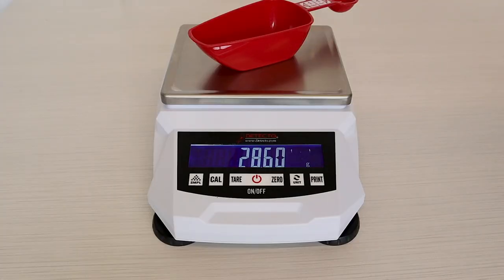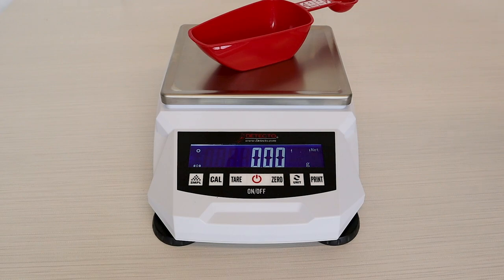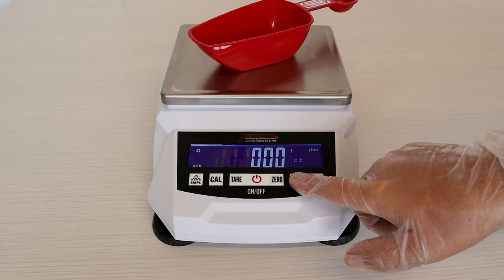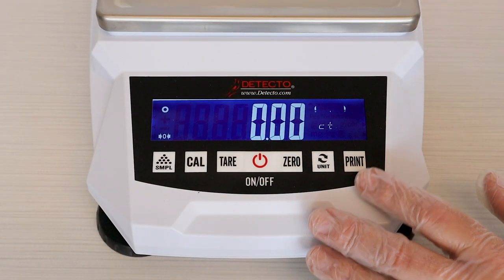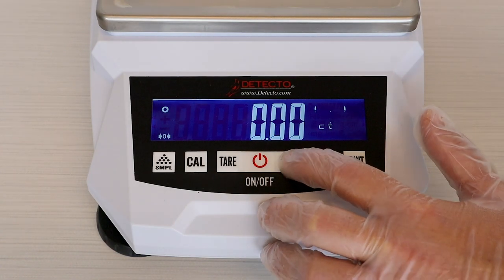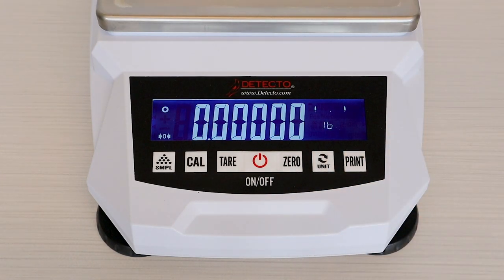You can tear off container weights and then add the product weight. Pressing the units key will change the weigh mode and go from kilograms to grams to metric carats, pounds, ounces, and so forth — there are 8 different units of measure. There's an enunciator, so when the user presses a button they know automatically that the button has been pressed by the beeping sound. The audible notification provides immediate confirmation.